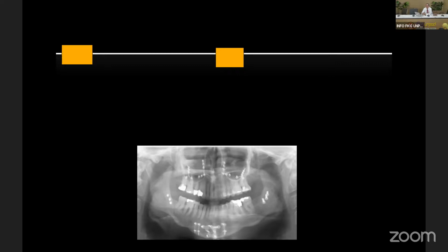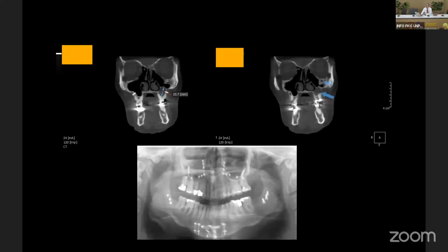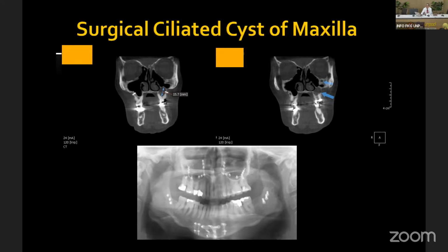After looking carefully, we still cannot see any abnormality in the left side of the maxilla, so we recommended a CBCT. With the CBCT, it's very easy to recognize that in the left side of the maxilla there's a cyst-like lesion, which turned out to be a surgical ciliated cyst of the maxilla. This kind of cyst is a post-surgical change.